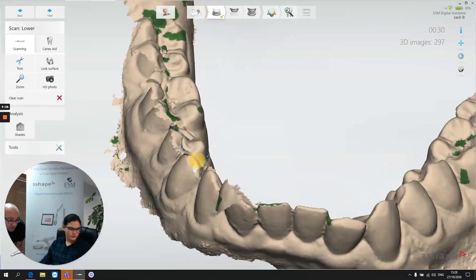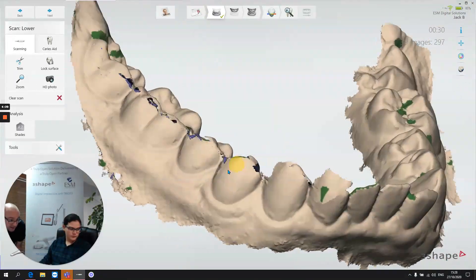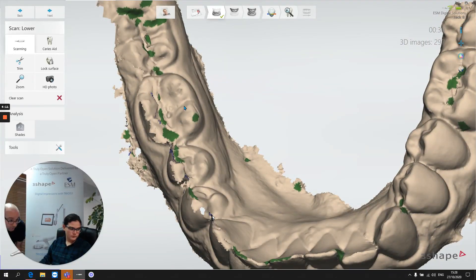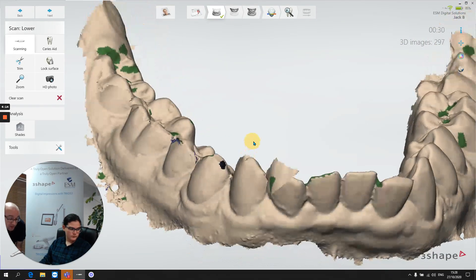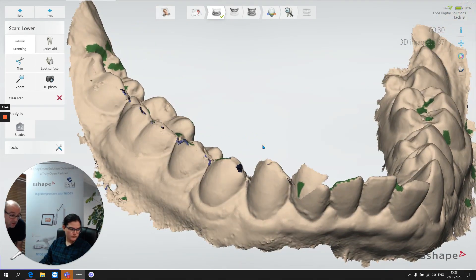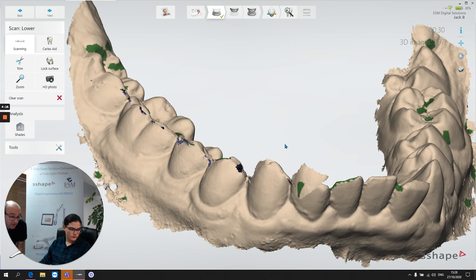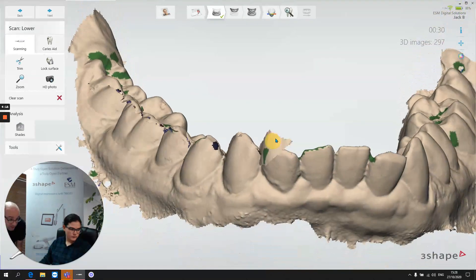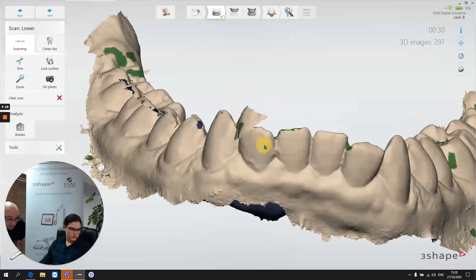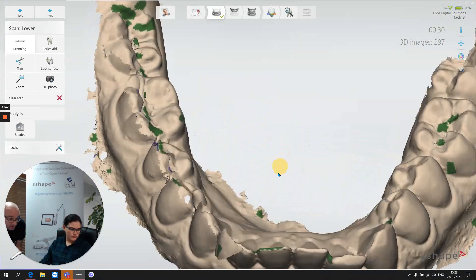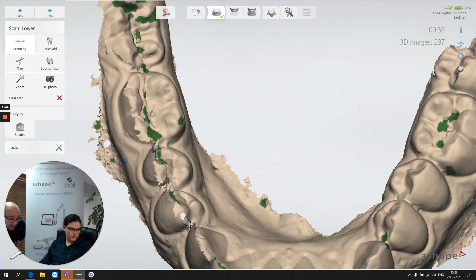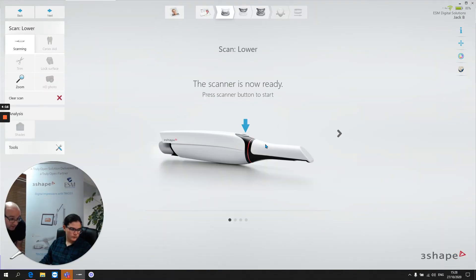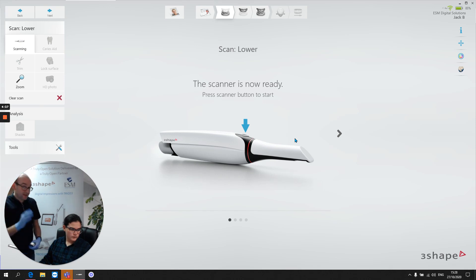And we could go in and try and scan that and try and fix it up and roll from lingual over to buccal and try and patch it up. The only thing is we don't know what we're trying to patch up. We don't know what's good and what's bad. And the only solution here really is to hit clear scan and be done with it. That's the best thing to do.